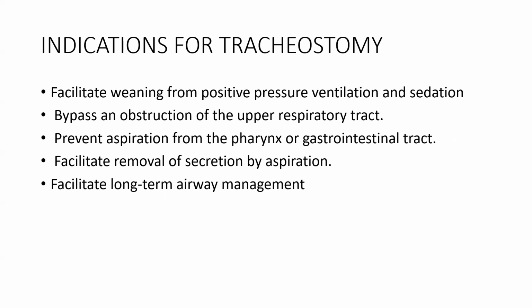So the indications for tracheostomy are: to facilitate weaning from positive pressure ventilation and sedation, bypass an obstruction of the upper respiratory tract, prevent aspiration from the pharynx or GI tract, facilitate removal of secretions by aspiration, and facilitate long-term airway management.